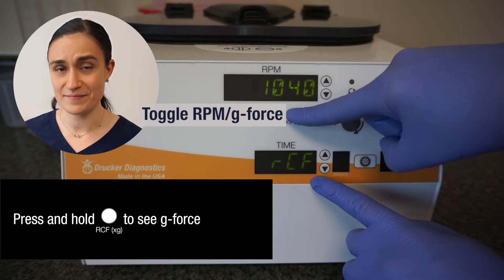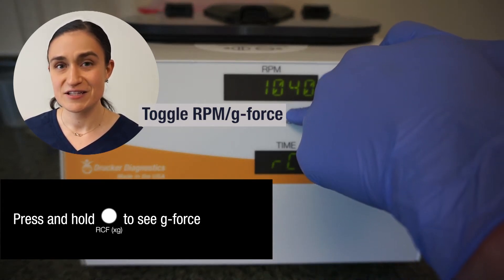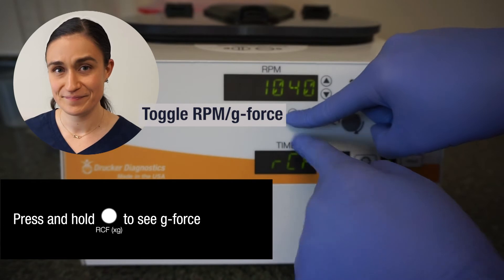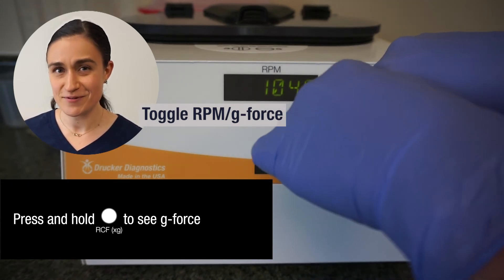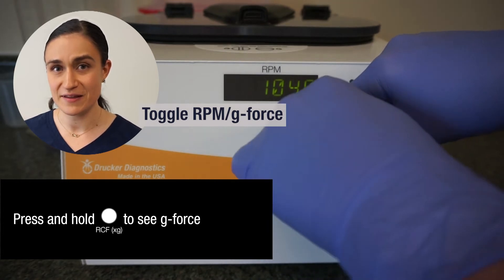When I have my G-Force displayed in the RPM screen, I can use the buttons to the right of the RPM screen to adjust by G-Force instead of by RPM — I just need to keep holding in that button. Keep in mind that as I adjust either my RPM or my G-Force, that number will change dynamically to represent the new currently selected speed, so the currently shown value is the one that I will spin.